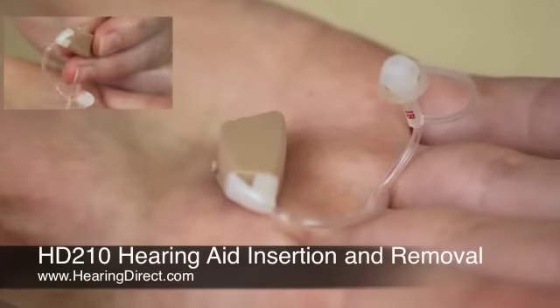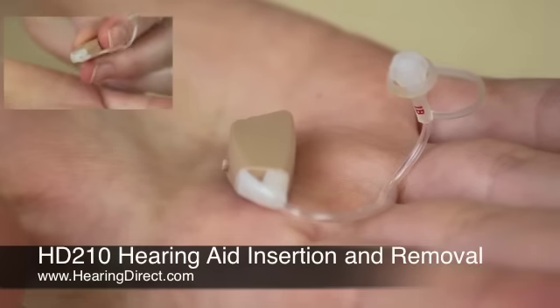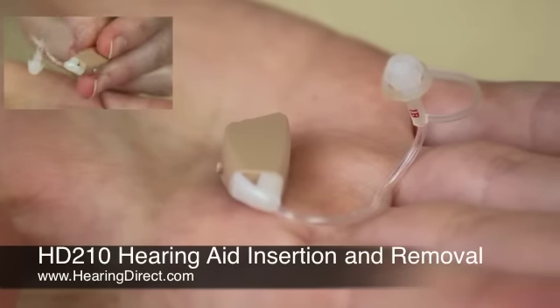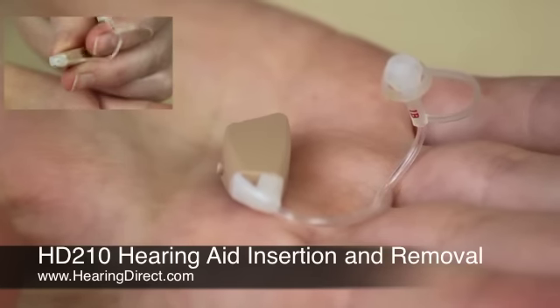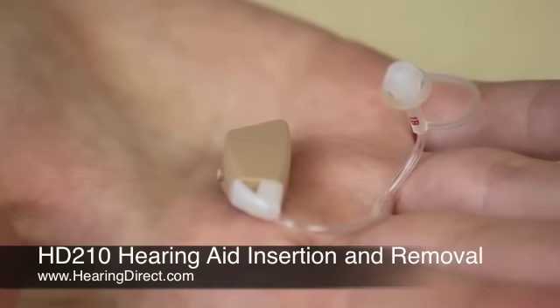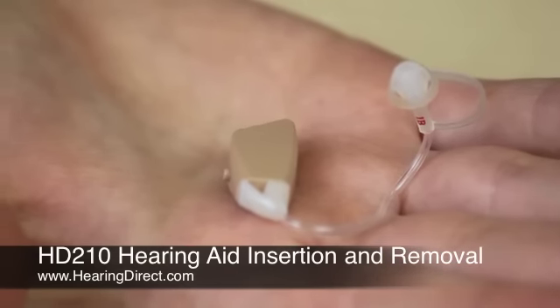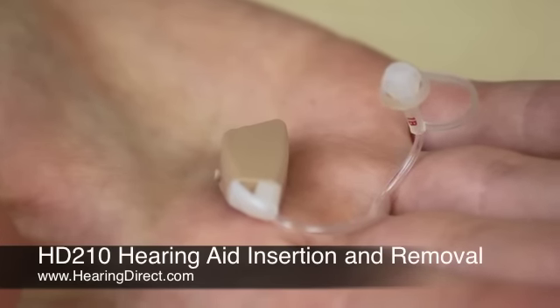This is the HD210. It is a behind-the-ear instrument fitted on what are referred to as thin tubings or micro-tubings. These micro-tubings end in what are referred to as domes. The domes and the tubings come in different sizes. We will always send out a product with a medium size as the default.